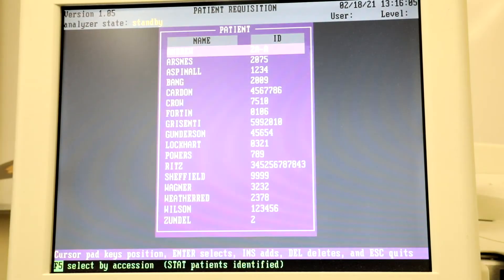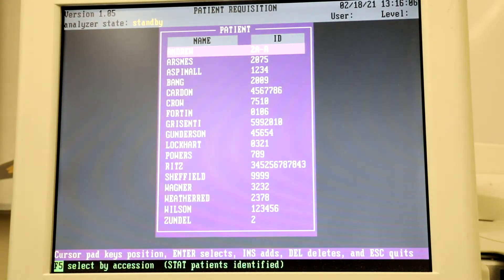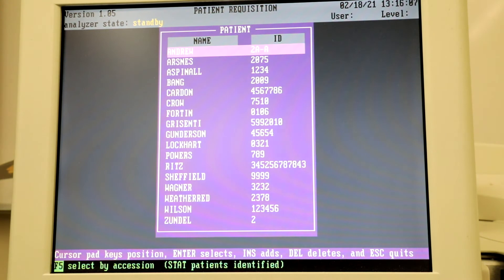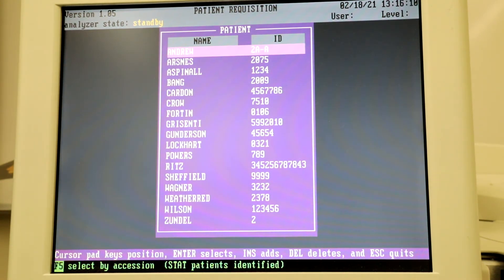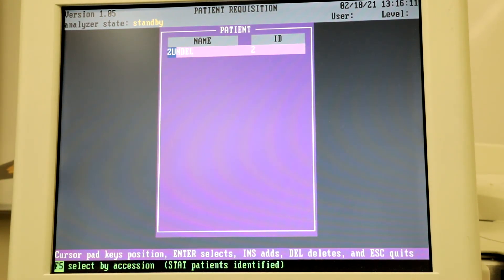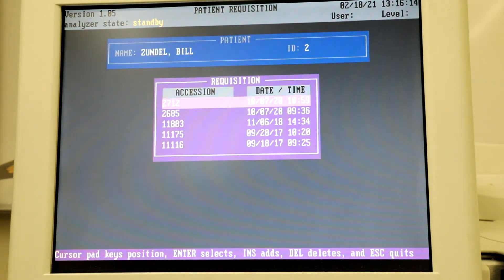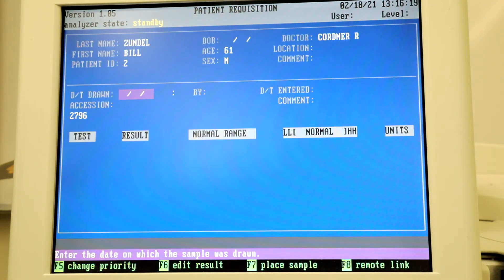Select R for Requisition then P for Patient. If you see yourself on the list, you can type the first few letters of your name and then select your name. Hit INS to add new accession.